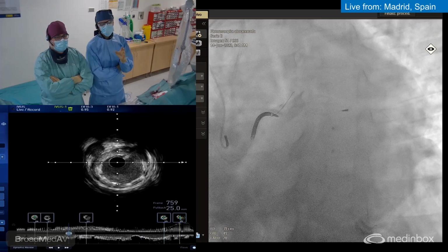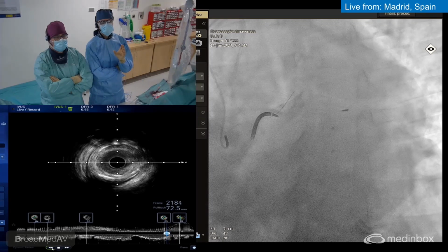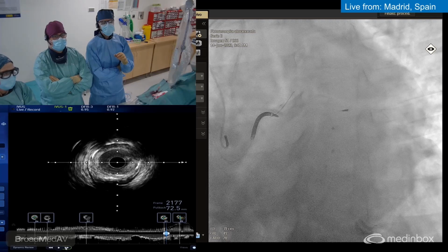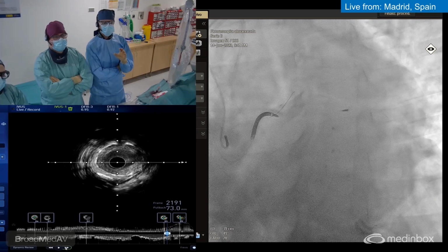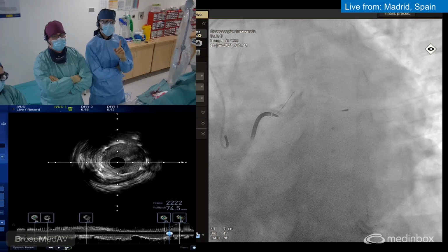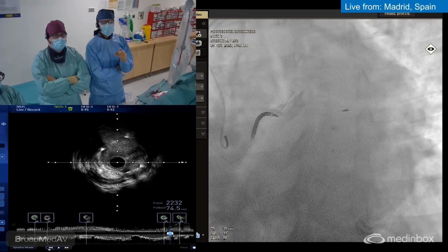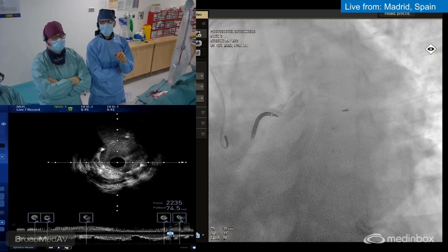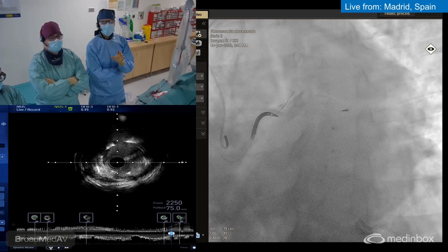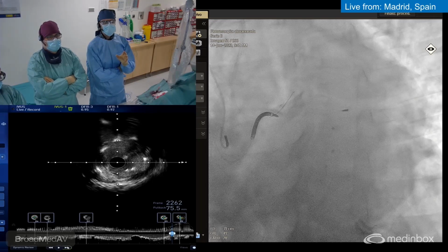And then if you follow distally, frame by frame, probably... No, distally to analyze the ostium of the LAD. Okay, proximally now, frame by frame, please. This is the proximal LAD, and you're going to see the wire in the left main at the 12 o'clock. There, stop. This is the wire of the intermediate branch, and probably the 2.75 stent of the LAD is protruding 1 millimeter and something, or 2 millimeters, in the left main. Continue proximally, please.